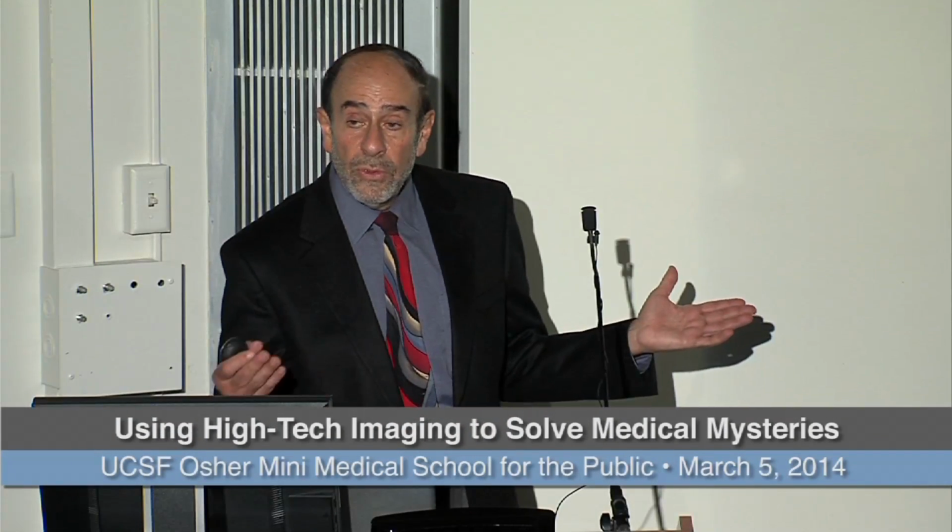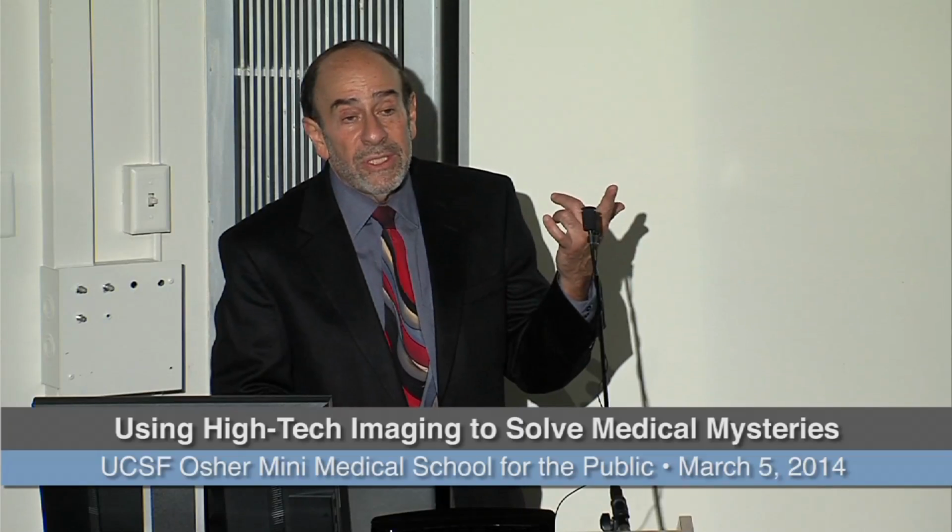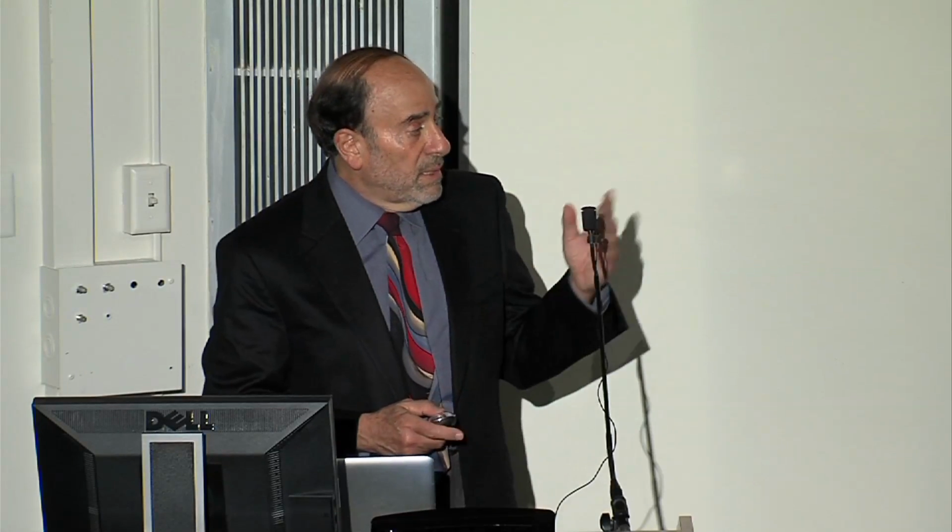And the patient doesn't move. They can hold their breath through the entire scan, as opposed to maybe 3 images, breathe, some more images. So by the time they got through breathing, the organs are in different places. Much, much better. Well, MR is a little slower, but we have ways to do that really fast now, too, as that's developed. So technology has changed radiology dramatically, and it's given us better detective tools over the years.